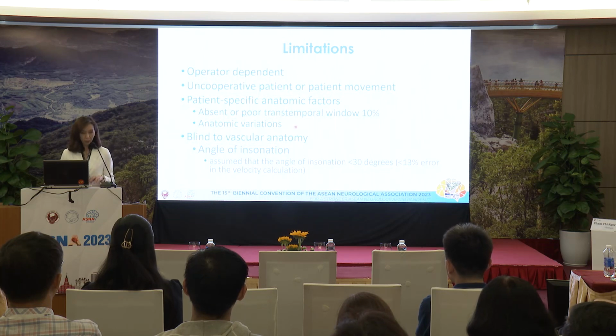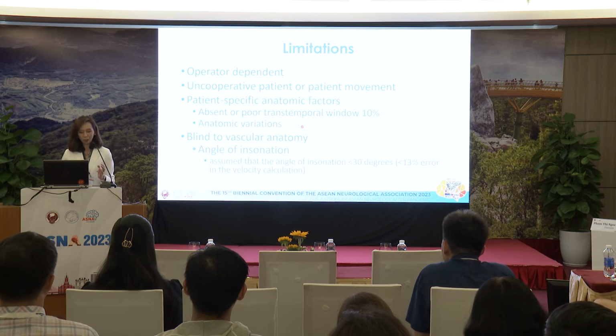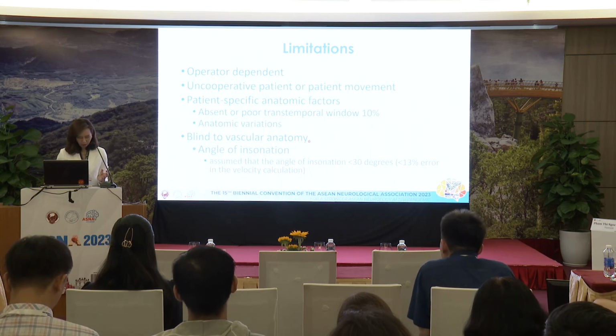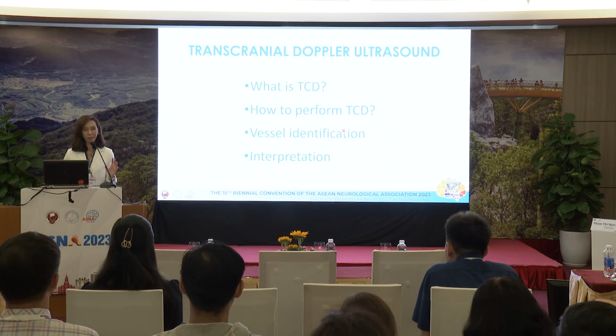And some variations of the anatomy, because we don't see the anatomy, so we just blindly look at it, some of the variations, so we won't know. And then the angle of insonation, so we can't correct it because we don't know the anatomy.